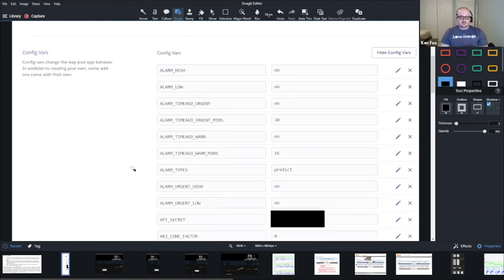This is a fun one. Can I, yeah, go ahead. For a quick second, there's some people on here who don't have Nightscout up and running or haven't started it or don't have any idea. So just as, I know you said it, but let's say it again, what you're showing right now is part of what you set up when you are building Nightscout.